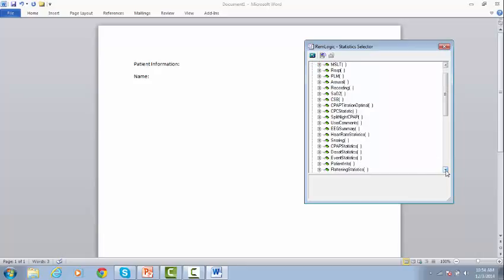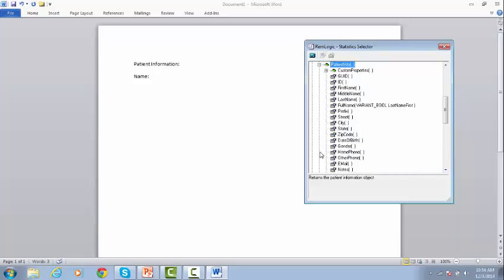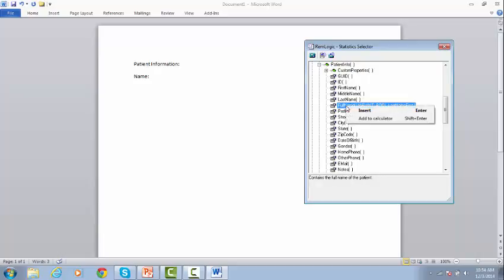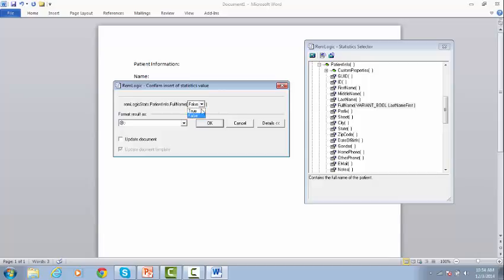We search for Patient Information. And from this menu, select the full name. Right-click on it, and click Insert. The statistics value window will pop up. Make the required changes, and click OK.